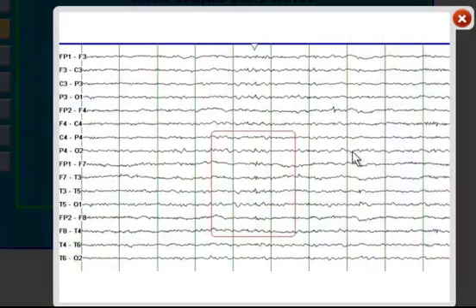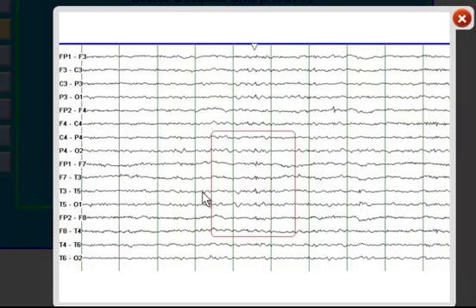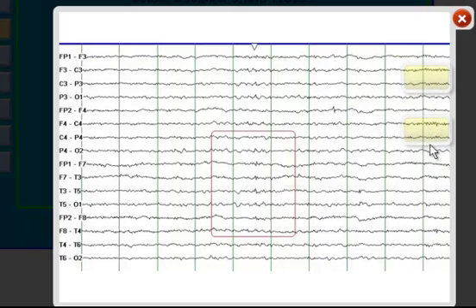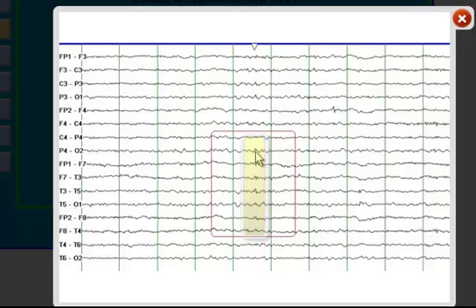In this box, what is the state of the patient? You do not see an occipital dominant alpha rhythm. You start seeing some sleep spindles here. So this is possibly stage 2 sleep. But what you see here, these things, these are called small sharp spikes, which is a benign variant and does not constitute a higher risk for epilepsy.